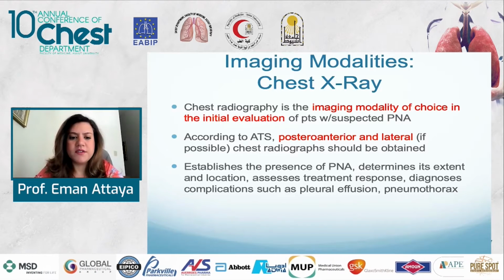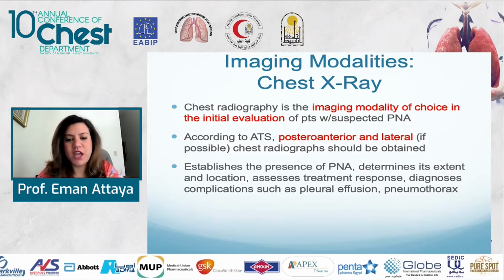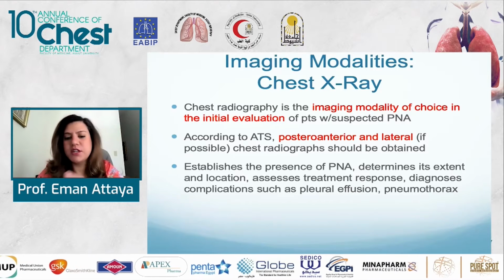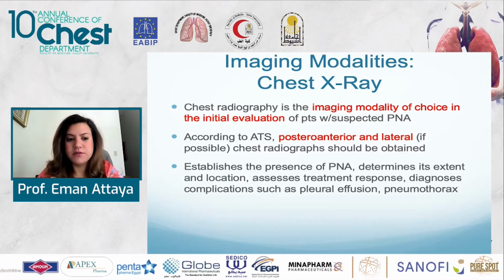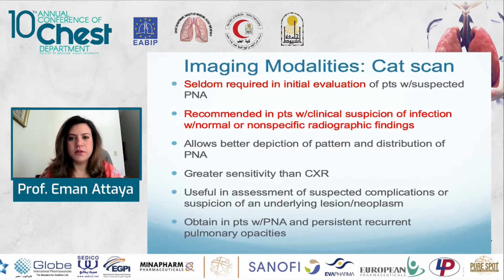And the chest radiograph establishes the presence of pneumonia. It determines its extent and location, assesses treatment and response. So after you've treated them for pneumonia, just get a chest x-ray to see if it's resolved. And it can diagnose complications such as pleural effusion and pneumothorax.